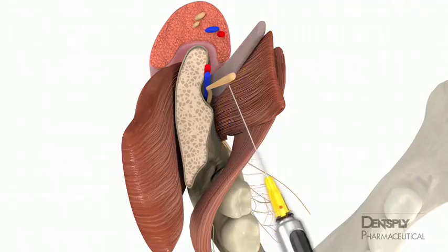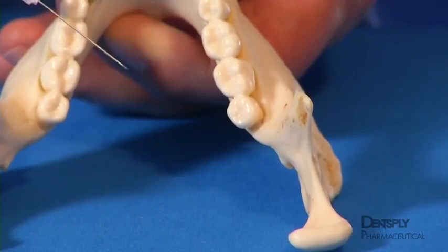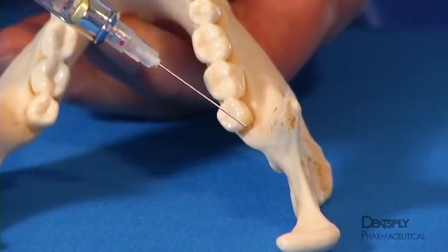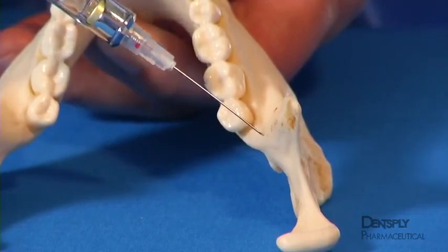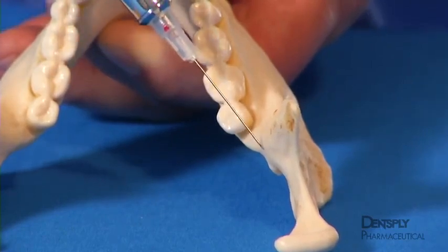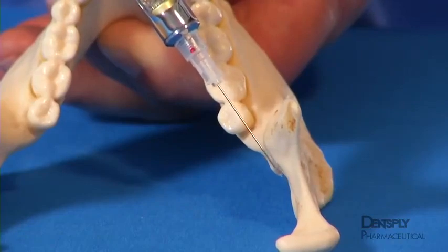In the few instances when anesthesia is not obtained, perhaps because the sphenomandibular ligament and attendant fascia prevent lateral spread of the local anesthetic, re-injection will be necessary. To ensure that bone is contacted during the second injection, the insertion point can be moved slightly more lateral to the pterygomandibular raphe as the syringe is oriented over the contralateral mandibular first molar region. Then, when bone is contacted, gentle repositioning of the syringe and probing with the needle until it is felt to drop into the mandibular sulcus can be performed.